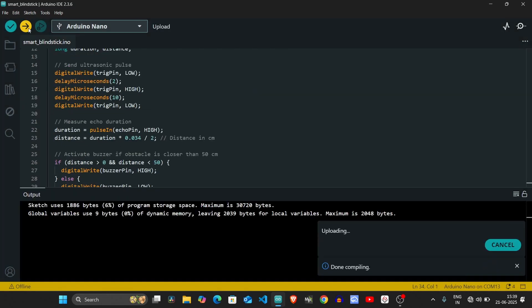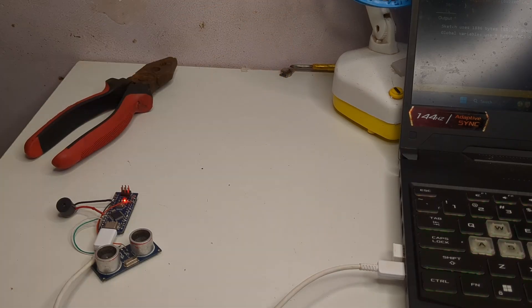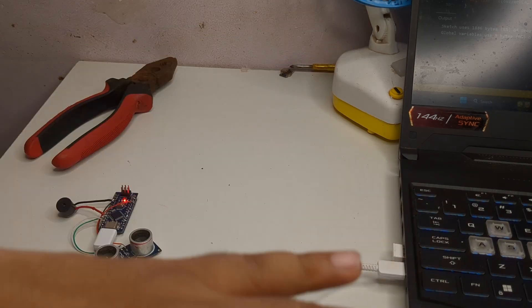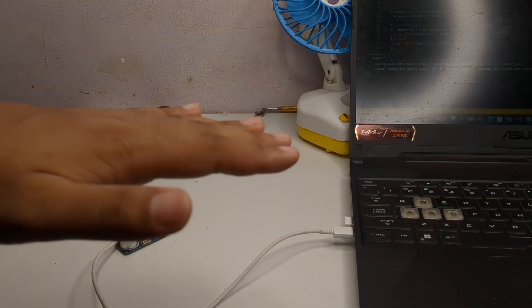Now it was time for testing. I moved my hand in front of the sensor and the buzzer made a sound — that means the sensor was working correctly. I was very happy to see this small success.